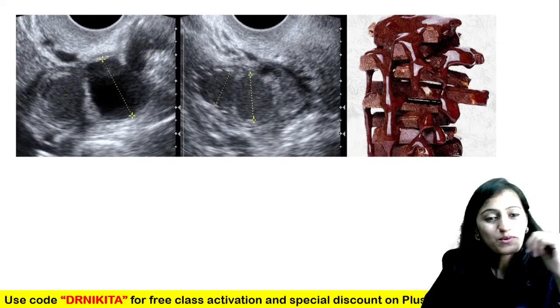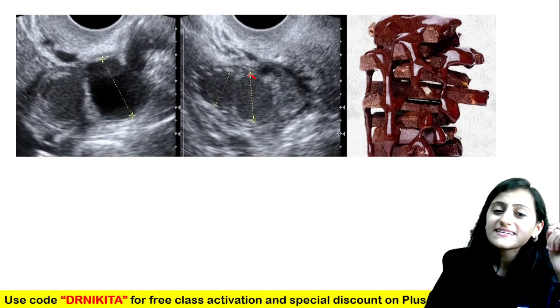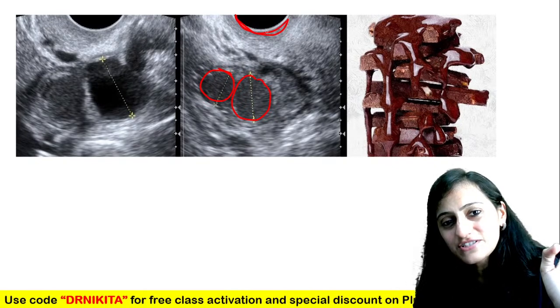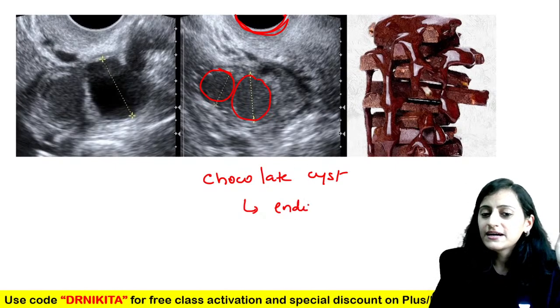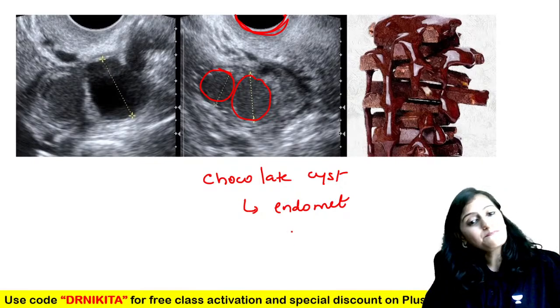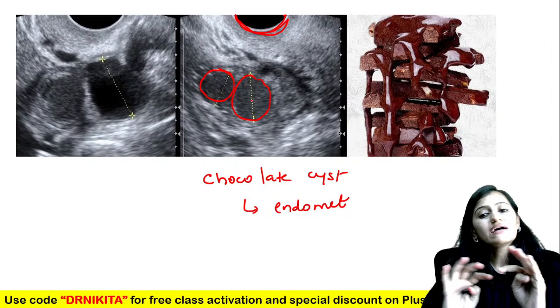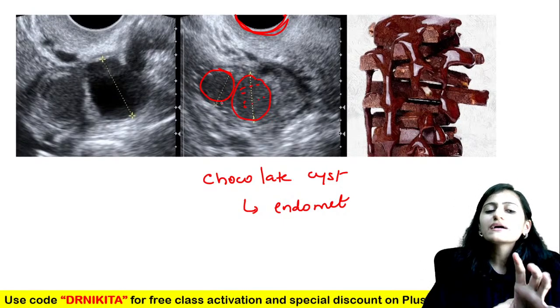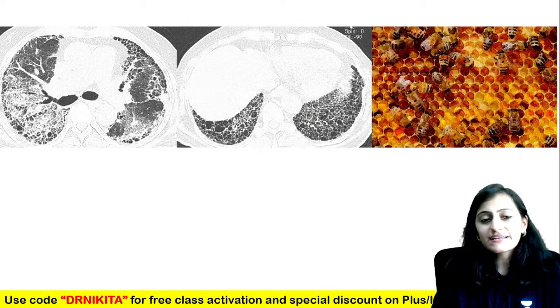This is the chocolate cyst in the ovary, seen on transvaginal sonography — this is endometriosis. Why is it a chocolate cyst and not a simple cyst? Simple cyst has clear fluid appearing black on ultrasound. Here the cyst has multiple low-level echoes, indicating a hemorrhagic cyst — that is the chocolate cyst of endometriosis.